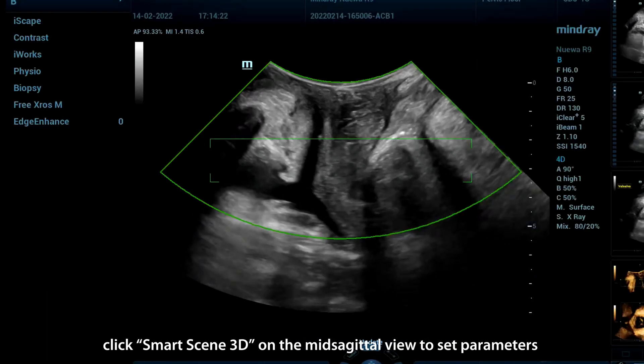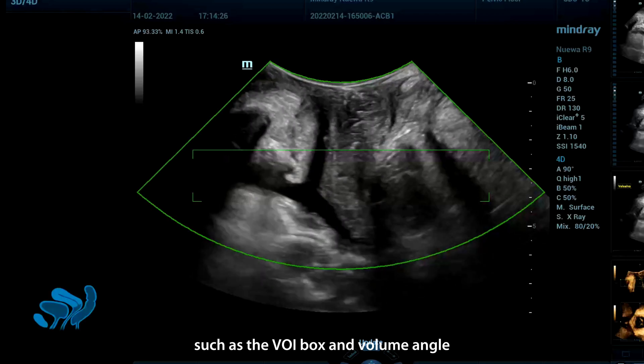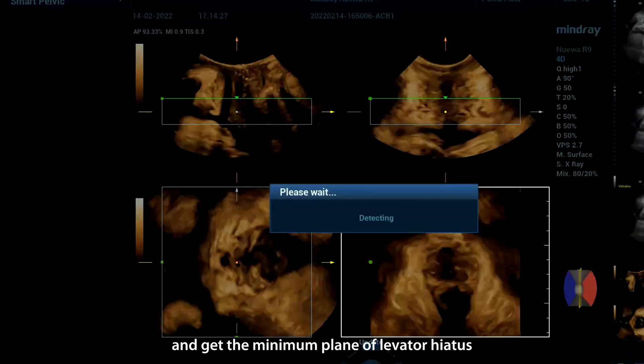Click Smart Scene 3D on the mid-sagittal view to set parameters such as the VOI box and volume angle, and get the minimum plane of levator hiatus.